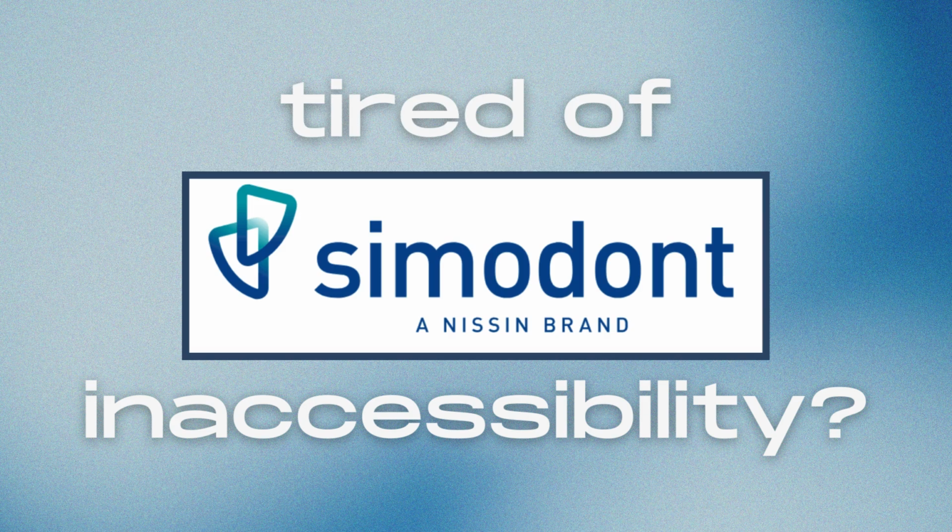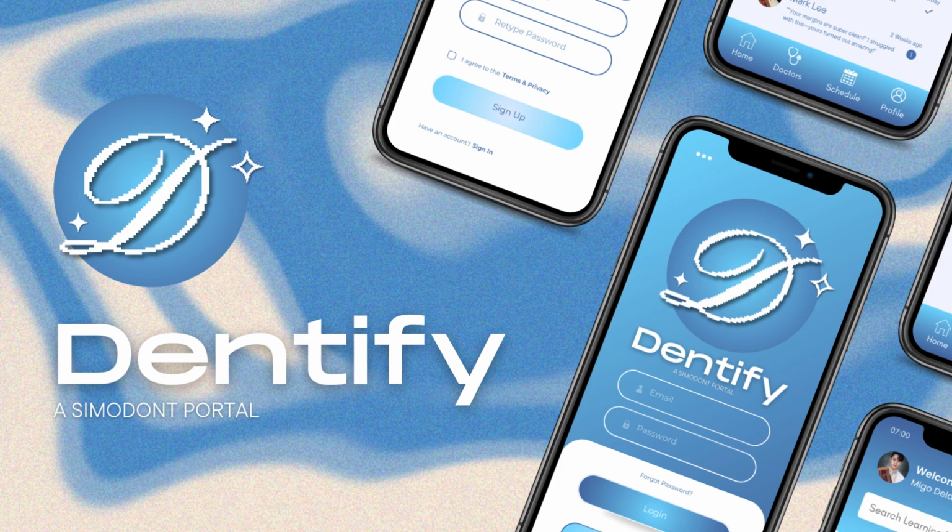Are you tired of the Simodont inaccessibility in the college? Here's to revolutionizing dental training with just a tap. Meet Dentify, delivering hands-on dental simulations right to your fingertips, available anytime, anywhere.